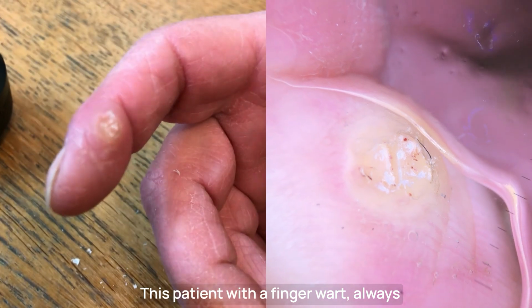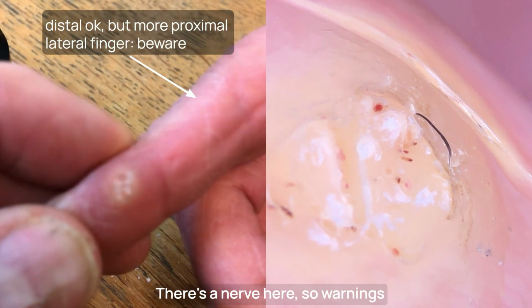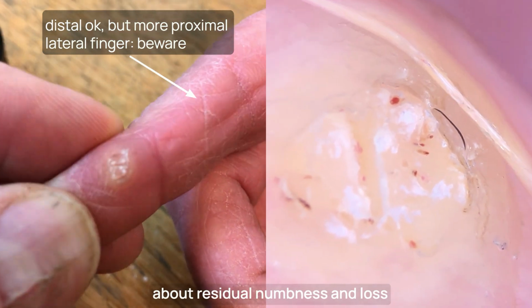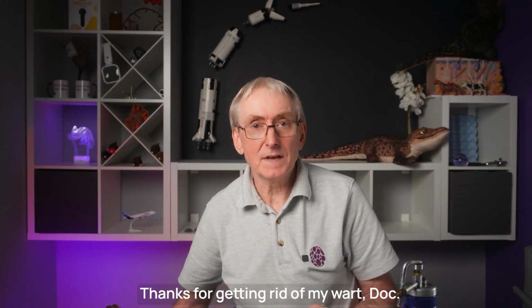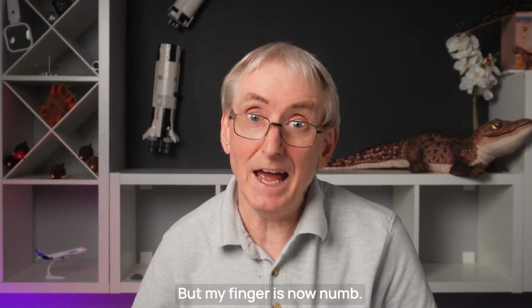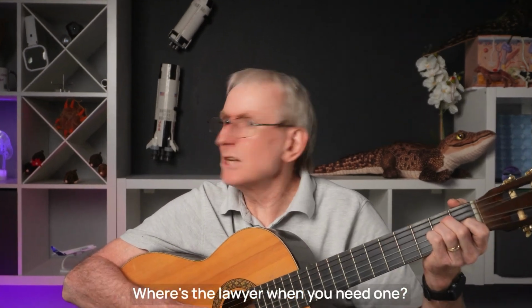For this patient with a finger wart, always consider the area below your freeze zone. There's a nerve here, so warnings about residual numbness and loss of sensation would be needed, even if the risk of nerve damage is small. Thanks for getting rid of my wart, doc, but my finger is now numb. I'm a rock band guitarist and I've lost my living. Where's a lawyer when you need one?